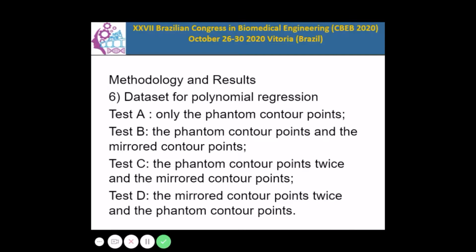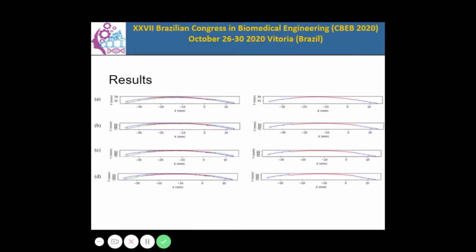The bone defect starting and ending points delimit the region for calculating the similarity measures. The evaluation region is not appropriate because this set of points comprises the bone defect edges, which are present in the gold standard and therefore in the phantom identically. This would artificially reduce the error between the two datasets.